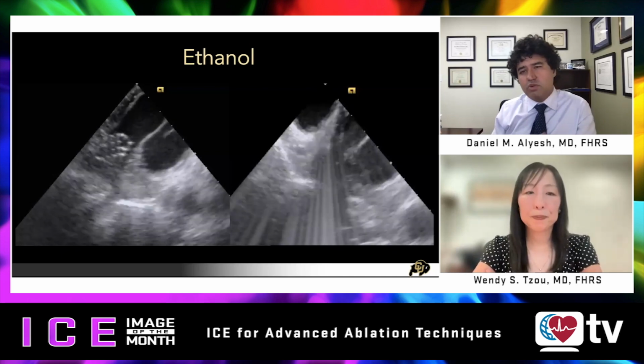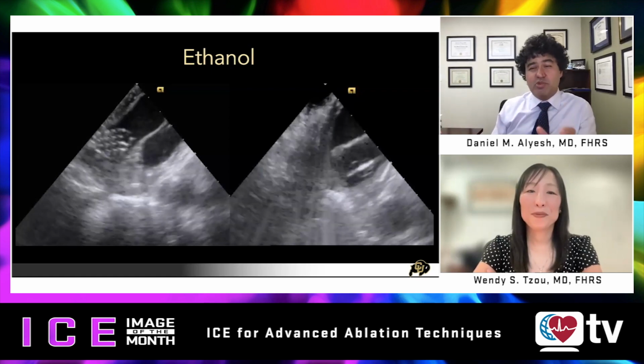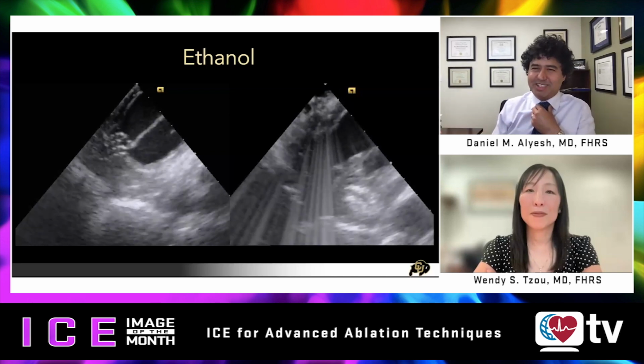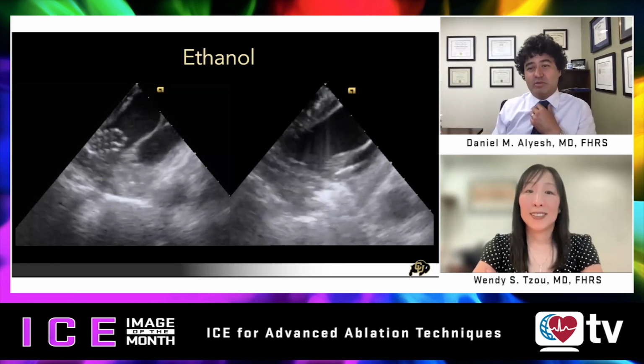Yeah. So I'm going to take us on a little detour. We've shown a couple of LV Summit examples, and in my experience, LV Summit is not as rare as I would like it to be.